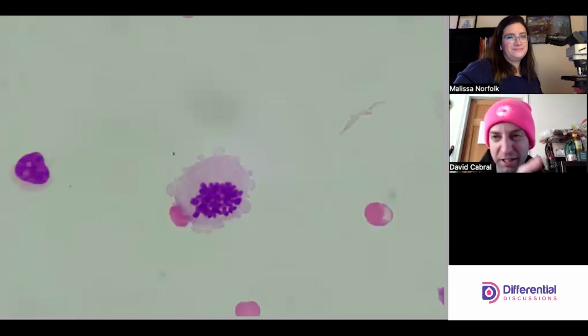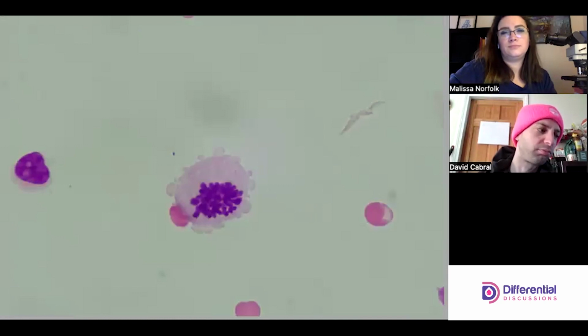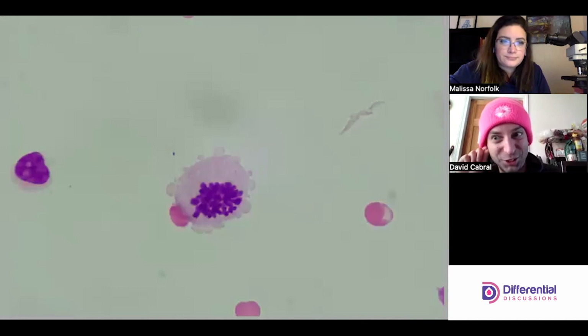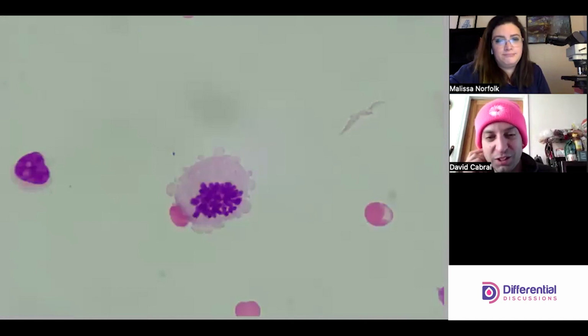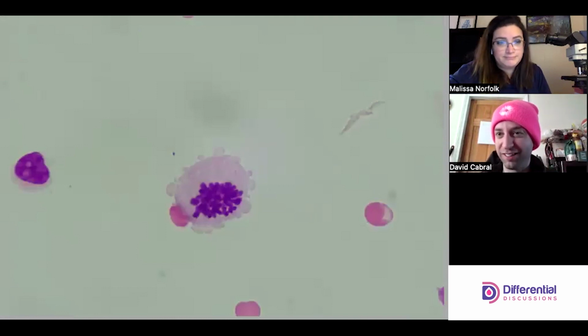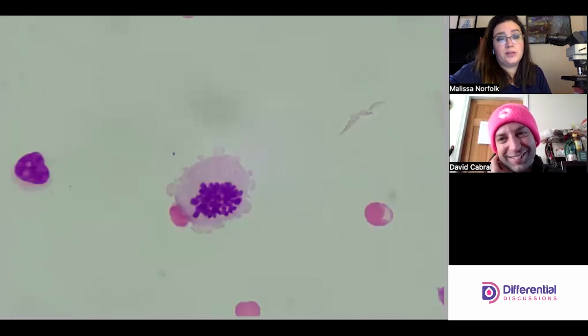Oh, sweet. I think different labs will handle this differently. This would be called a mitotic form, and I think oftentimes it's a qualitative sort of finding. Mitosis is normal physiology, right? But bad things do mitosis too. So honestly, kind of above our pay grade. It's something that we note and alert on. Pretty cool though. For those first two mesothelial cells we saw, I'd want a second opinion on them.